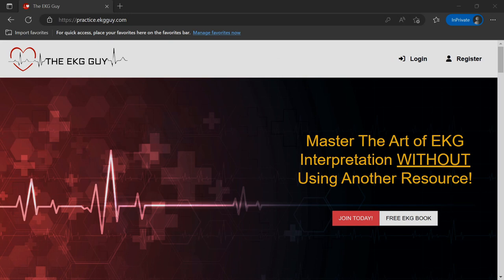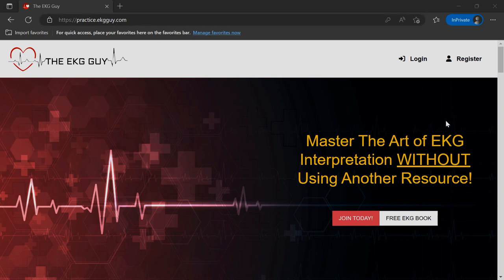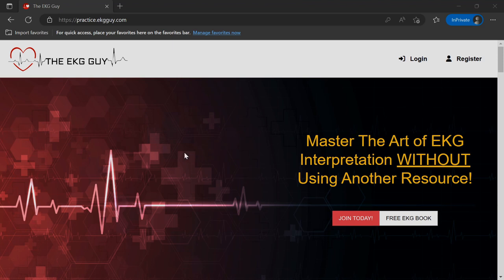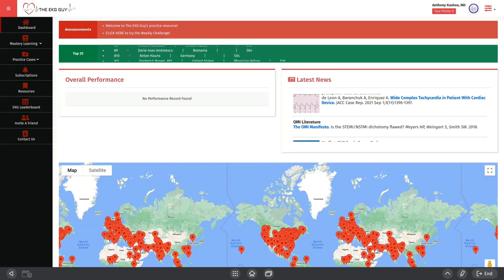If you want to follow along with this interpretation, go to practice.ekgguide.com, register if you haven't, or log in if you already have an account. Registration is free. Once you log in, we're going to go to this case.